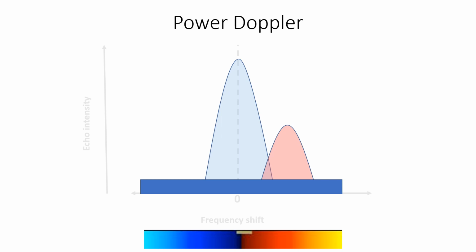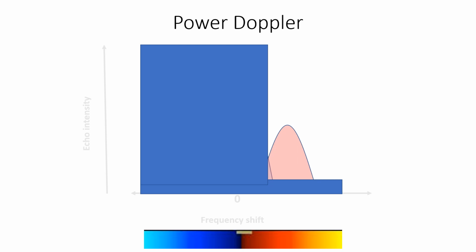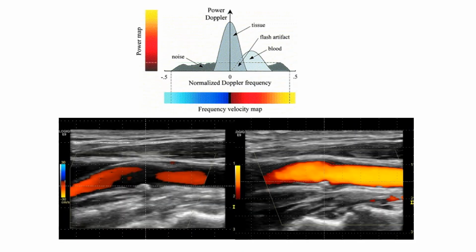Power Doppler uses a very different approach to flow visualization. It eliminates the areas with Doppler shift below the set threshold and displays color that reflects not the Doppler shift, but the intensity of the echo. This difference in modalities provides complementary information. The color Doppler shows the direction of the flow and a qualitative assessment of its velocity. The power Doppler visualizes areas of the flow that are not displayed by color Doppler, the near wall flow and the turning point of the vessel.